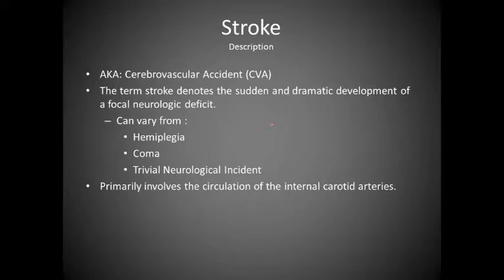So that brings us to one of the common, or probably the most common thing that you'll ever encounter in terms of CT. The patients that are having a stroke. And so let's just throw this out there and get it off the table right now, that not everyone who comes in having stroke-like symptoms is having a stroke, but not all the people that we don't see a stroke on in terms of CT aren't having a stroke. And I realize that may not make any sense, but hopefully it will by the time that we're done.